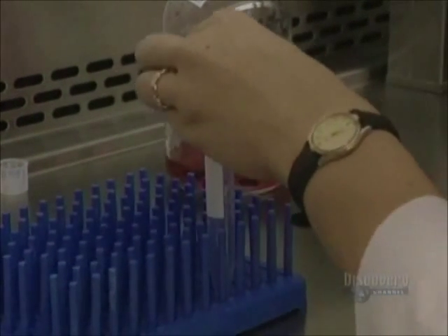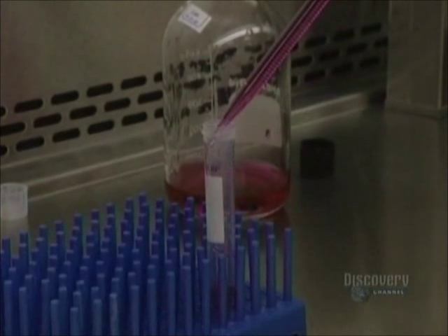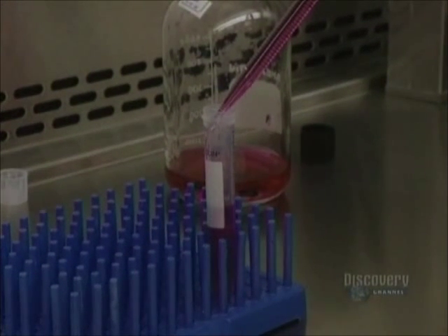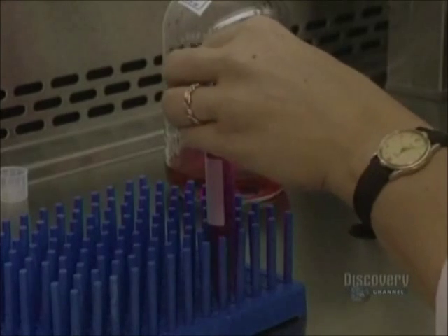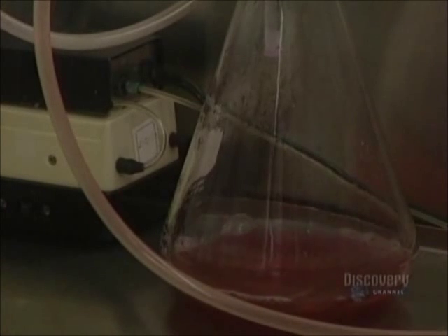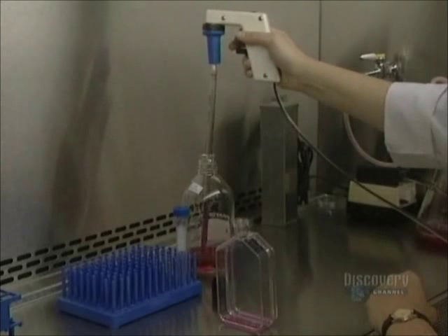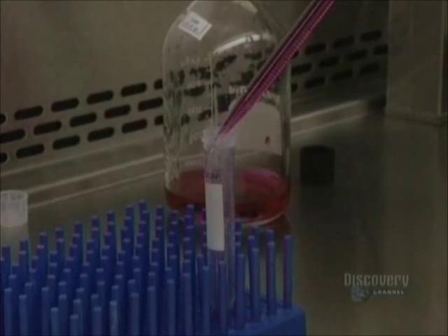Then the liquid containing the cells in suspension is drawn off. The liquid is centrifuged to obtain two fractions. The base fraction containing the desired cells is at the bottom of the tube, while the upper floating fraction containing the trypsin has to be removed. This upper fraction is drawn off with a vacuum system in order to eliminate all traces of trypsin.